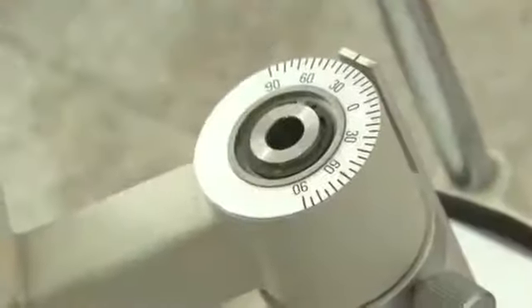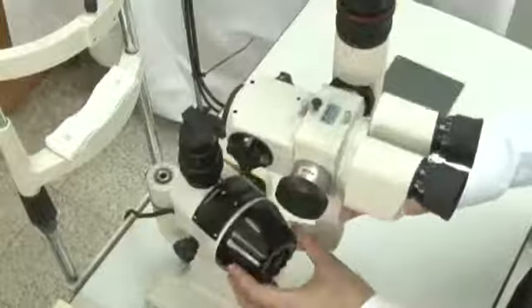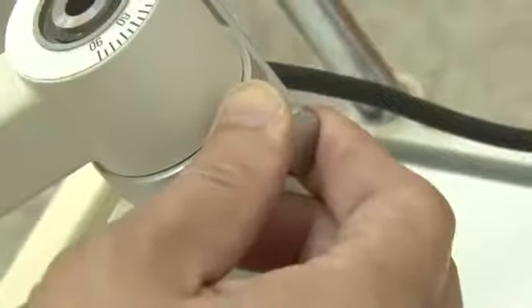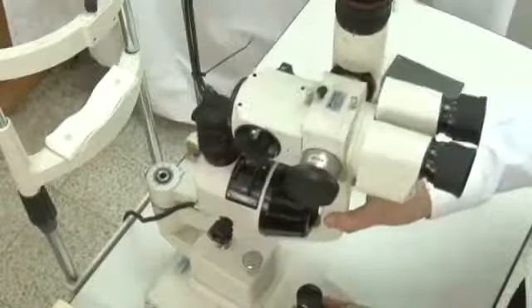The observation system and illuminating system rotate about a common axis as a single unit or move independently to create different angles between illumination and observation system. That makes different examination techniques possible.